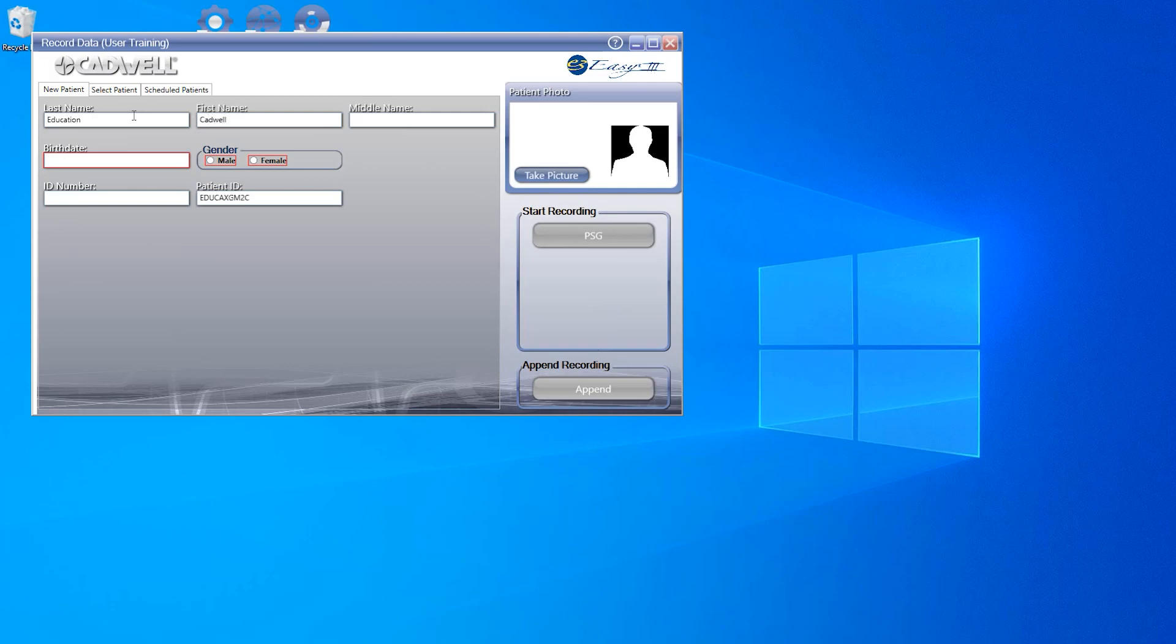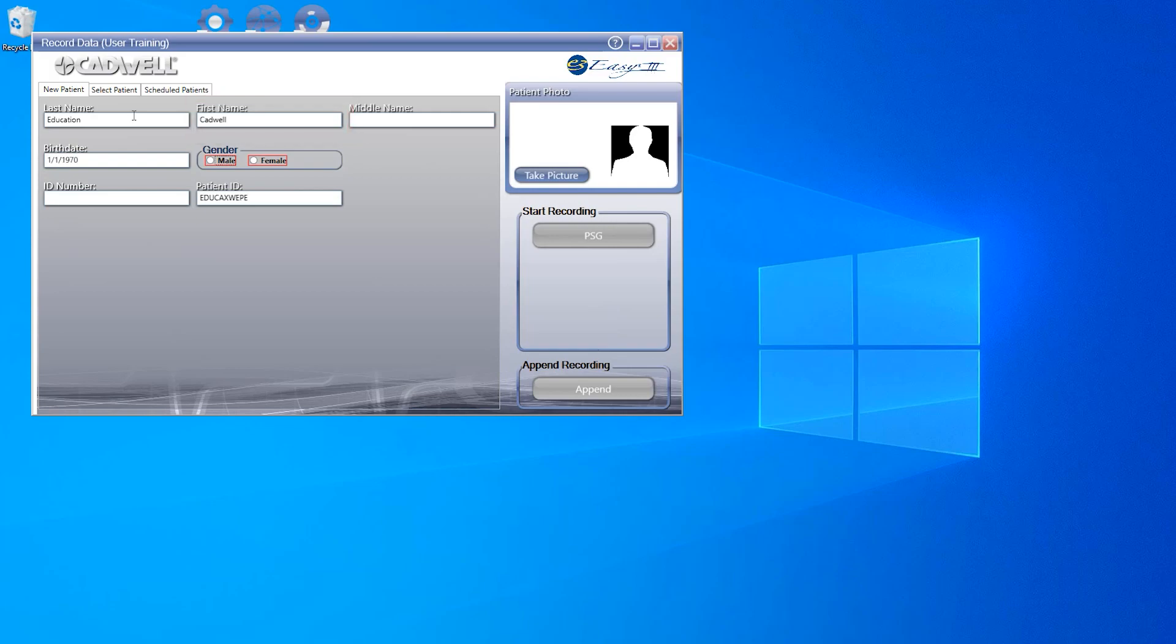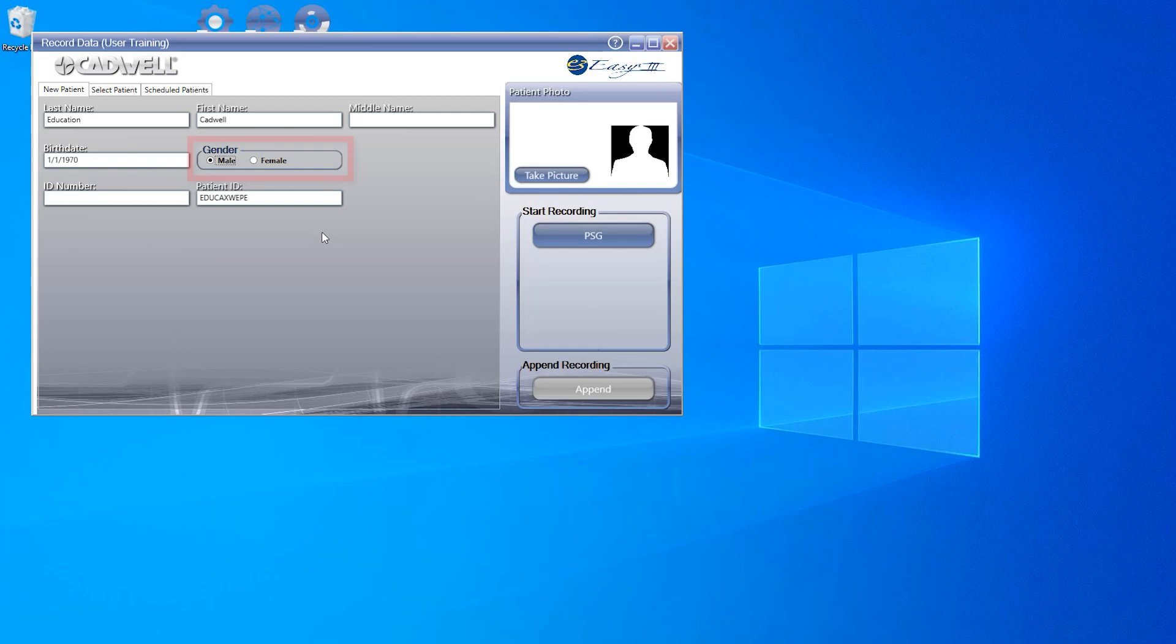Be sure to fill in last name, first name, birthday, and gender. As you fill in these fields, the patient ID field will create a generic ID for you. Your site may choose to keep this for your records, or you can enter your own ID information instead.